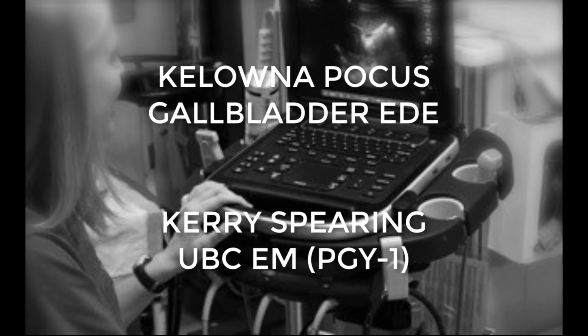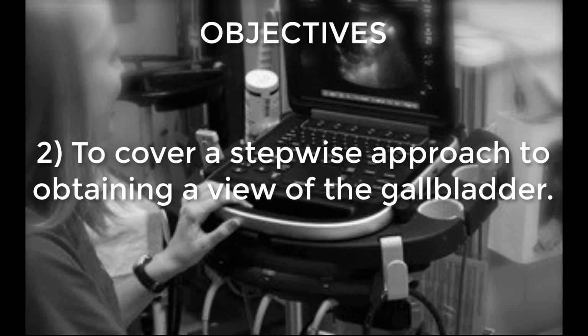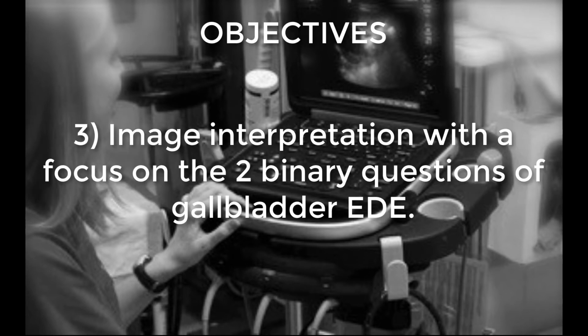My name is Kerry Spearing and I'm a PGY1 emergency medicine resident at the UBC Interior site. Today I will be talking about the utilization of ultrasound for gallbladder pathology. The objectives of my presentation are to review the indications for gallbladder POCUS, to cover a stepwise approach to obtaining a view of the gallbladder, and image interpretation with a focus on the two binary questions of gallbladder POCUS.